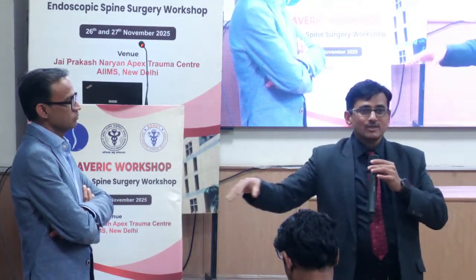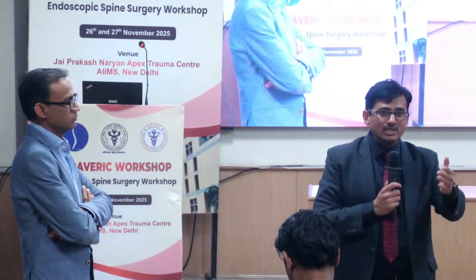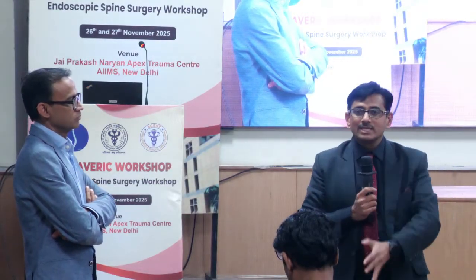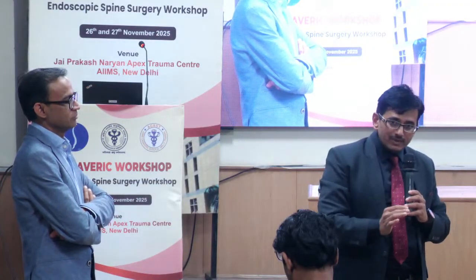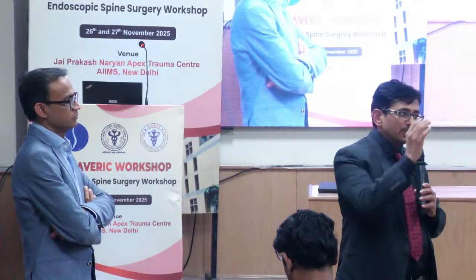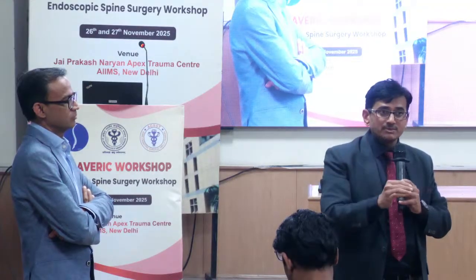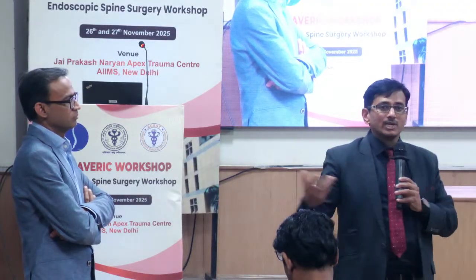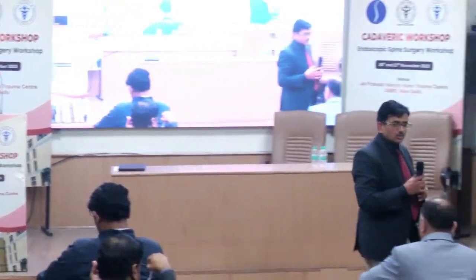So when you have a stable hand, you know how to operate. Then when you get more freedom, you can do a better job. So to transfer to UBE was very easy for me because I was doing Destandau. Dr. Rohidas was coming at that time, and Dr. Yadav was also doing Destandau, and he stuck to doing the EasyGo. Destandau was the advanced level, but if you are doing Destandau, then it is easier to convert to UBE. You feel that both your hands got free. So your previous experience, though it is open microscopy, this kind of tubular work won't go to waste. If you are an expert or have a little experience in that, UBE is just like an easy baby to take.